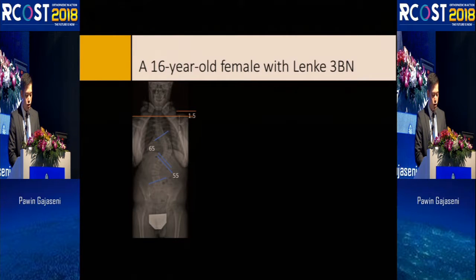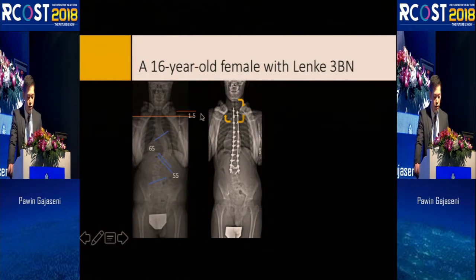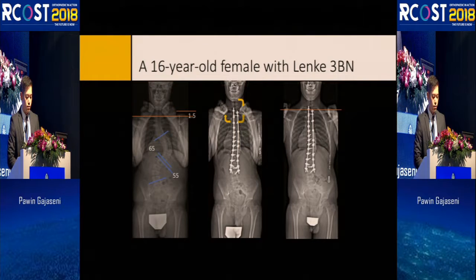This is an example of a 16-year-old female with Lenke type 3 curve. The main thoracic curve was around 65 degrees and the lumbar curve 55 degrees, and we used this technique. The shoulder difference was around 1.5 centimeters before surgery. We used a laminar hook inserted downwardly at the UIV level on the higher shoulder, and a pedicle hook inserted upwardly at the level just below the UIV, and another pedicle hook inserted upwardly on the side to push the lower shoulder up. After surgery, she had good main thoracic curve correction and shoulder balance.